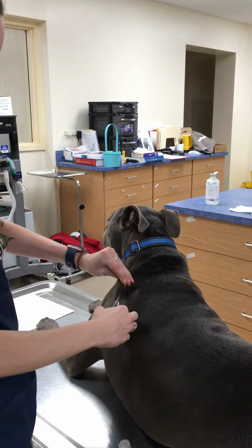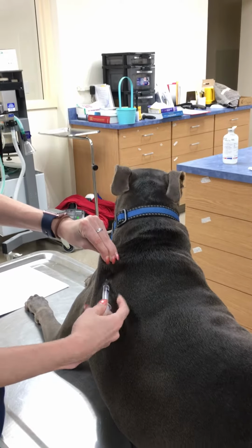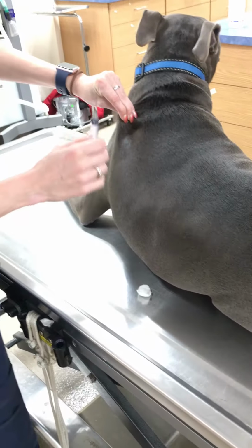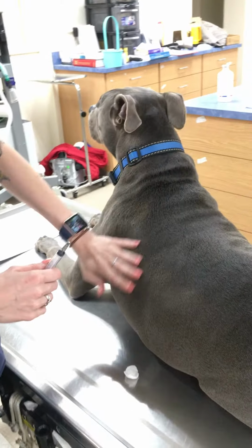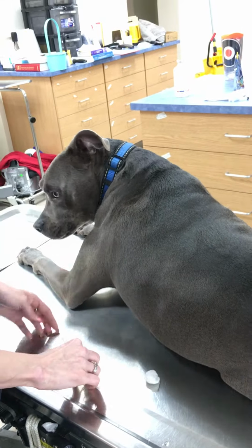And then I just simply bevel up. I go one poke, draw back to make sure I haven't hit anything, and then inject slowly. Once I'm finished with that, oh, I lost my cap. I'm just going to rub the skin, and at the same time I like to push up on the hair, make sure there's no capillary bleeding, make sure there's no medication. Oh, I found my cap. No medication leaking out of the injection site.